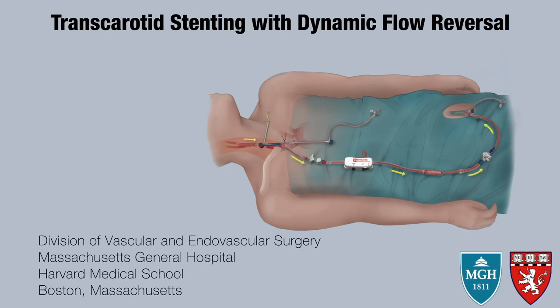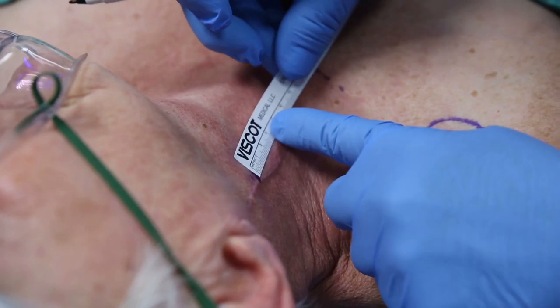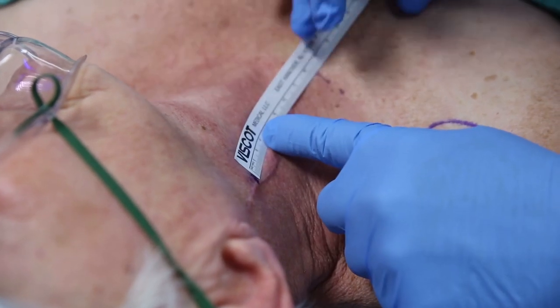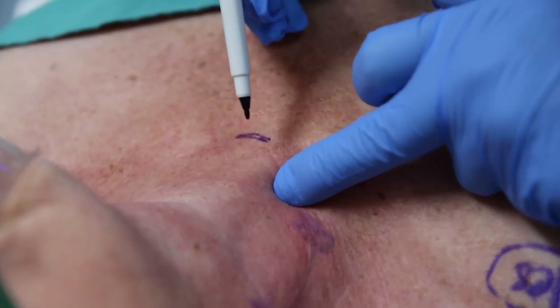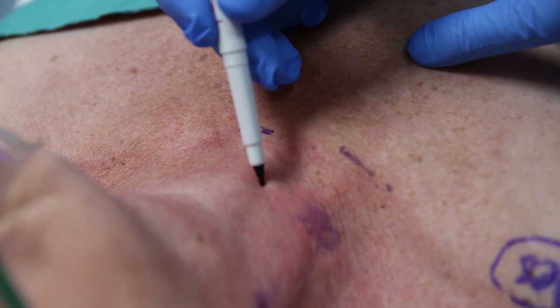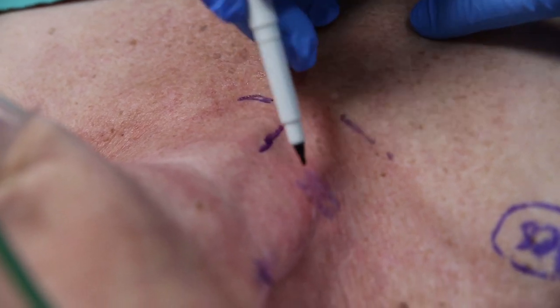The patient is a 77-year-old female with critical recurrent carotid stenosis after prior CEA, being treated with trans-carotid stenting using flow reversal as part of the Silk Road trial. The patient was placed in a supine position and a minimum distance of 5 centimeters between the carotid bifurcation and clavicle was confirmed by ultrasound.